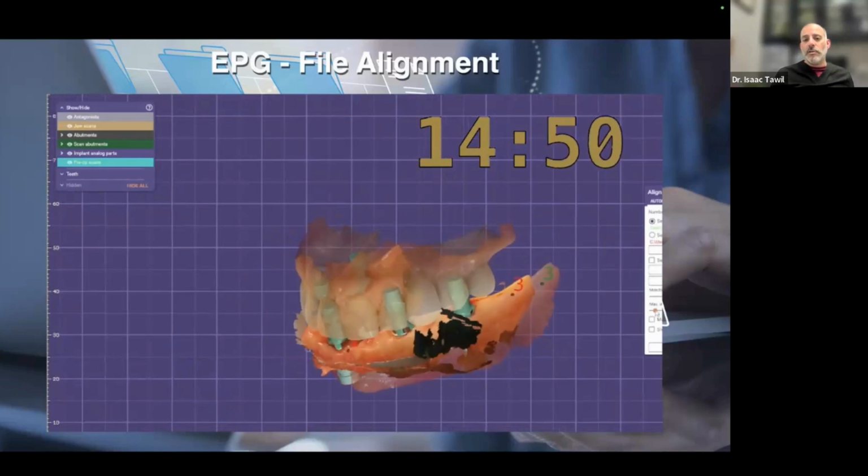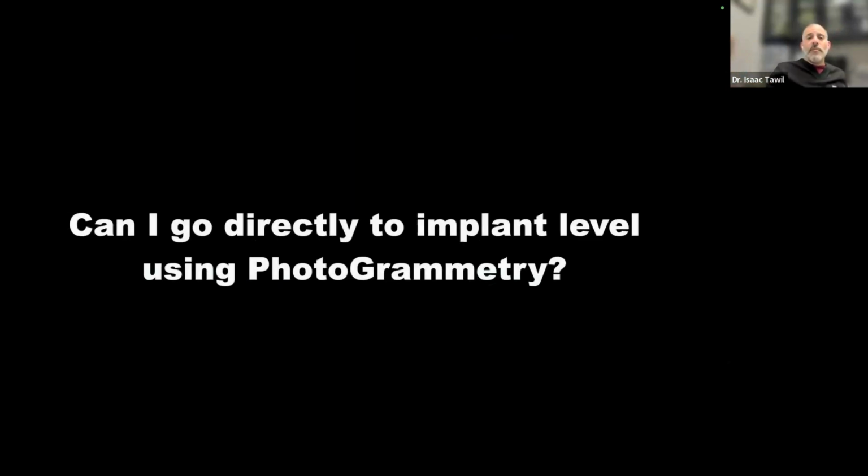And this is using a good friend of mine who does this very quickly, and he did it in around 14 minutes and 55 seconds. That could be fast for some people. Maybe some people take a little bit longer. Some can do a little faster, but that's roughly the time it takes to merge these files together. And again, you have to merge files. You have to find the files, have the files. Did they send the right files? That becomes more of the annoyance of it. So we end up having some of these errors that can occur in that as well.